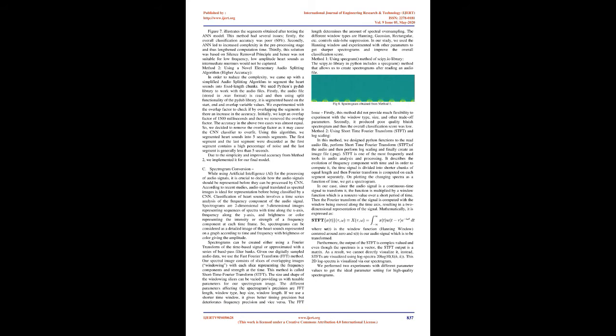The first segment and the last segment were discarded as the first segment contains a high percentage of noise and the last segment is generally less than 5 seconds. Due to the simplicity and improved accuracy from Method 2, we implemented it for our final model.